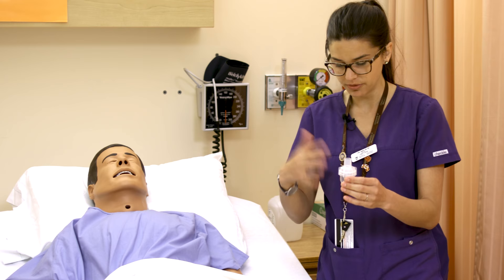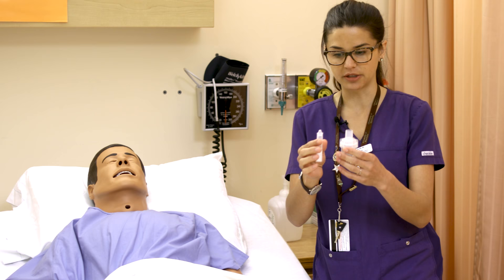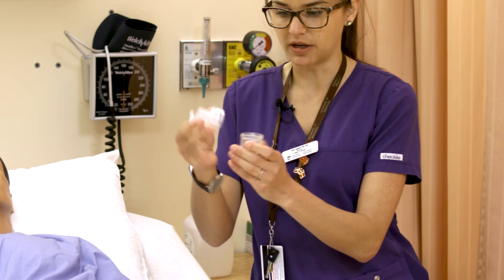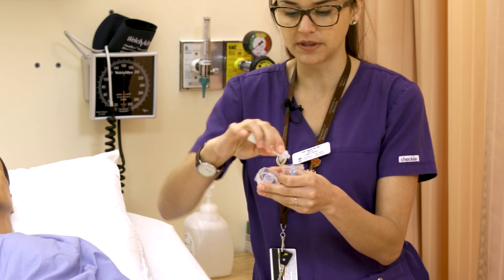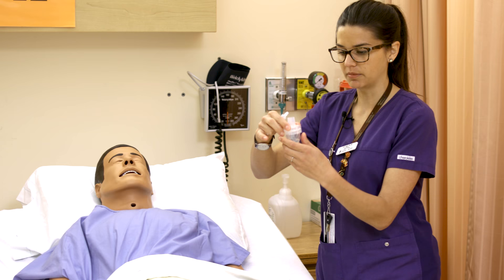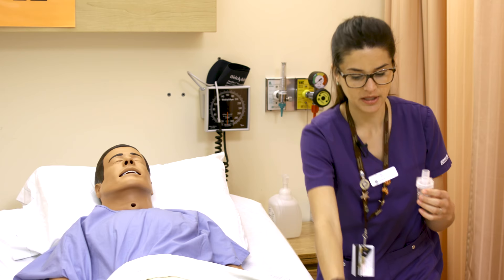You do need oxygen to run through this to aerosolize the medication. Once you've done all your checks — correct patient, correct medication, all your rights — you can go ahead and set it up. Open this cap here, it just spins off, and squirt the entire contents into the nebulizer canister, then close the top back up. Try not to move it around too much as it can leak, so hold it upright. The empty nebule then goes in the garbage.